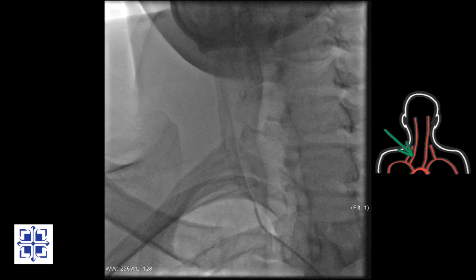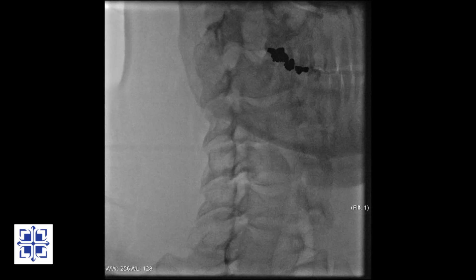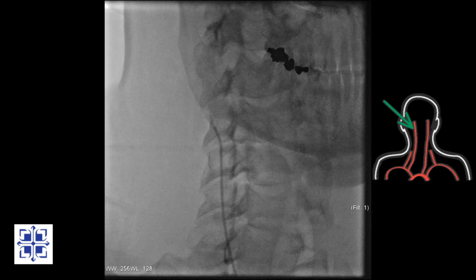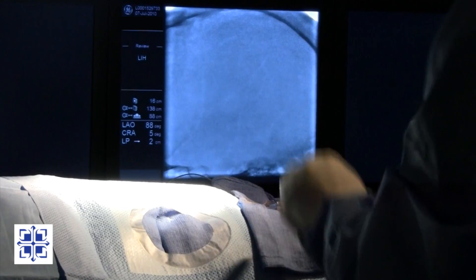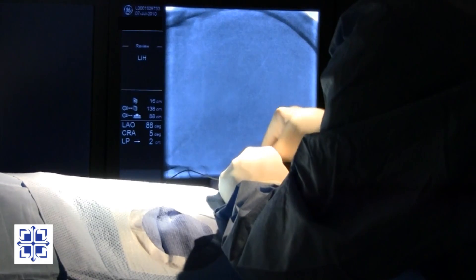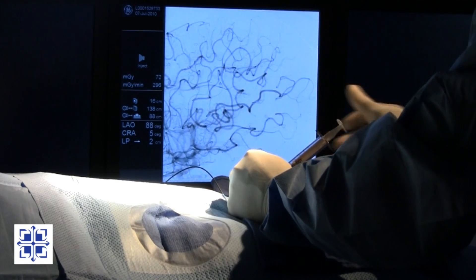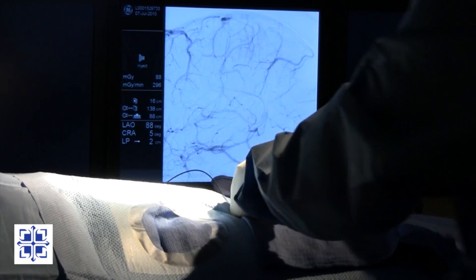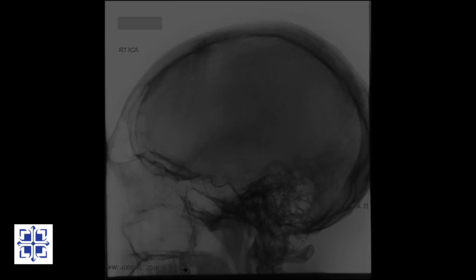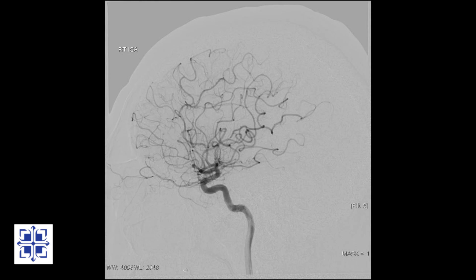I am moving the catheter to the right common carotid artery. Now we take a picture of the artery. Here is the same picture with digital enhancement. I am advancing the catheter to the right internal carotid artery so we can take pictures of the blood vessels of the right side of the brain. The contrast I am injecting is showing the arteries now. This enlarged, unenhanced picture shows the skull and the brain's right-sided blood vessels. Digital enhancement removes the bone from the picture, highlighting the blood vessels.